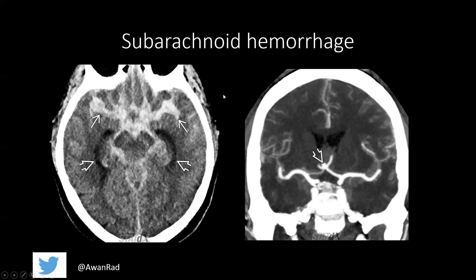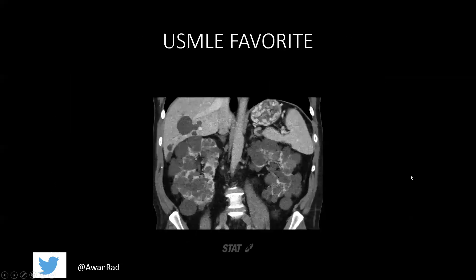Subarachnoid hemorrhage is mostly due to either trauma or rupture of an aneurysm. Here is a coronal CTA image showing the right ICA, left ICA, the MCAs bilaterally, the anterior cerebral arteries, and at the anterior communicating artery there is a focal dilation or outpouching of contrast — this is an anterior communicating artery aneurysm. A focal dilation or outpouching of a vessel is what you look for when identifying an aneurysm on CT.